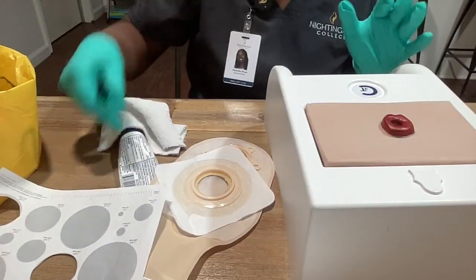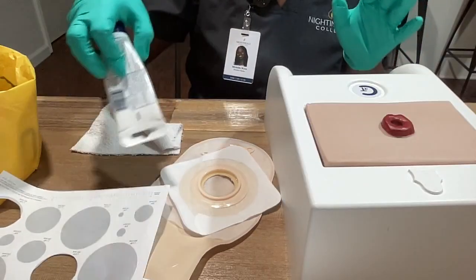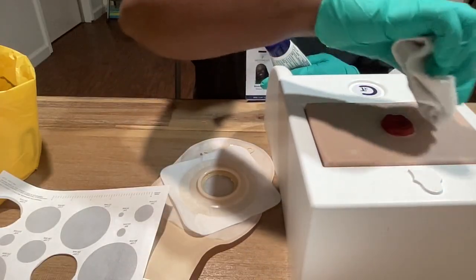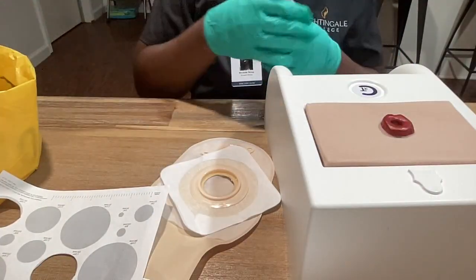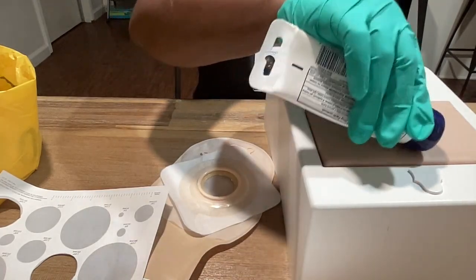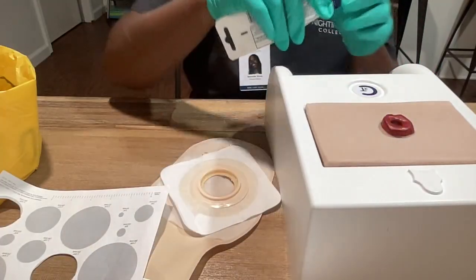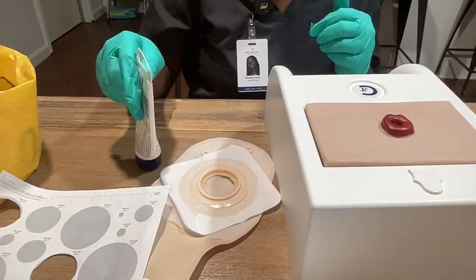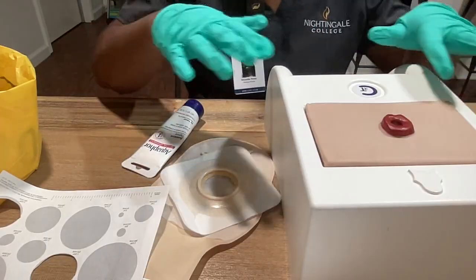Now that that has been done, I want to pat the area dry and dispose of that. Next, I'll be applying my stoma paste around the stoma area. The stoma paste creates an extra seal and it can help prevent skin irritation. I need to let that dry.